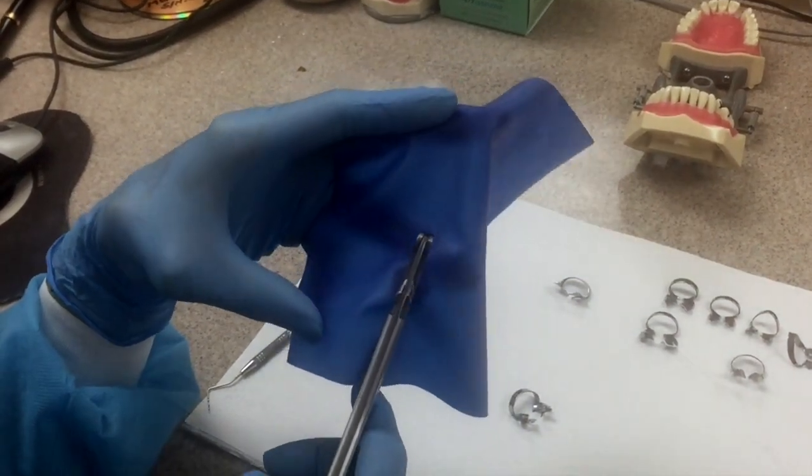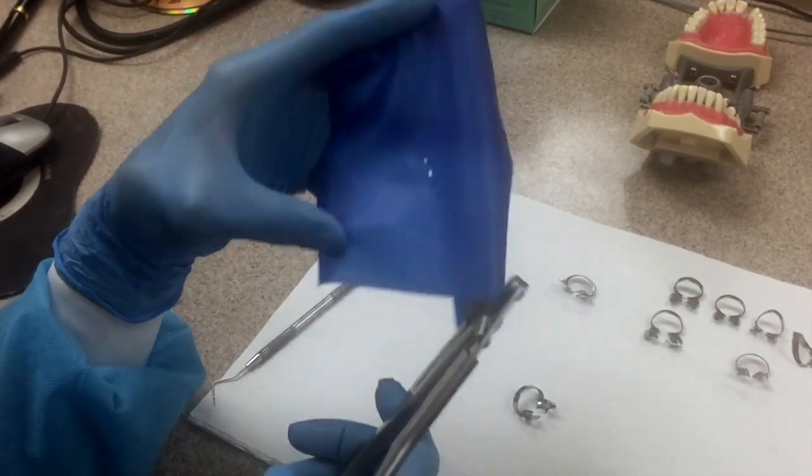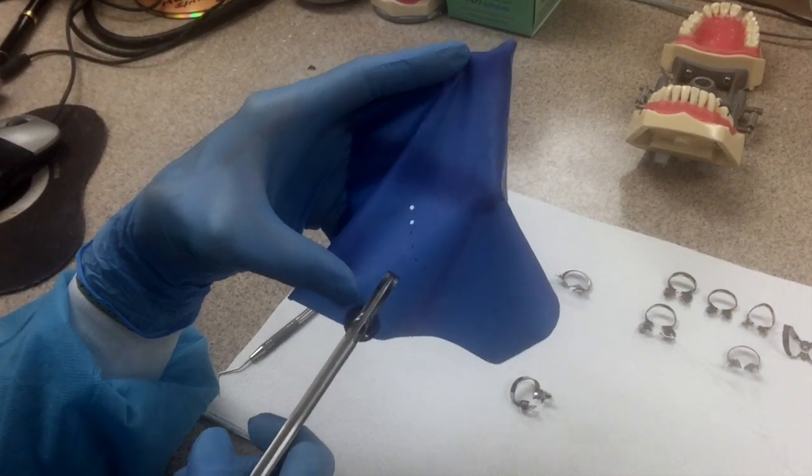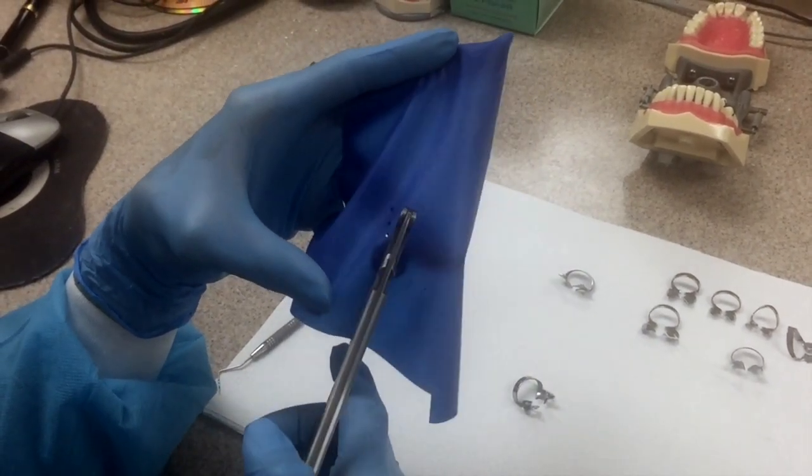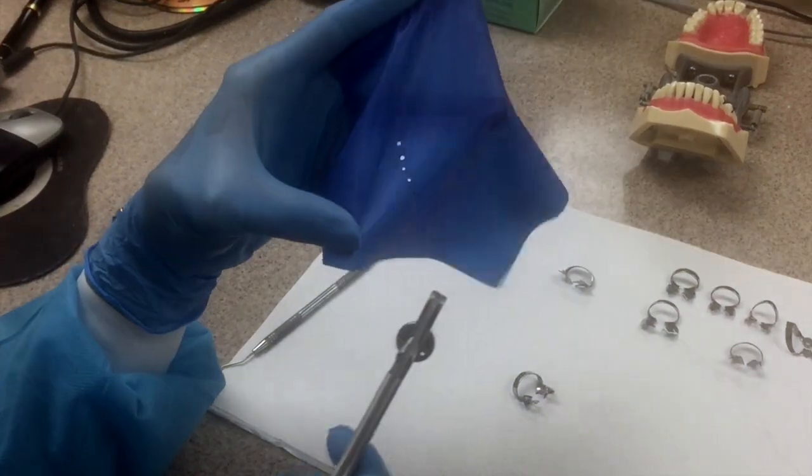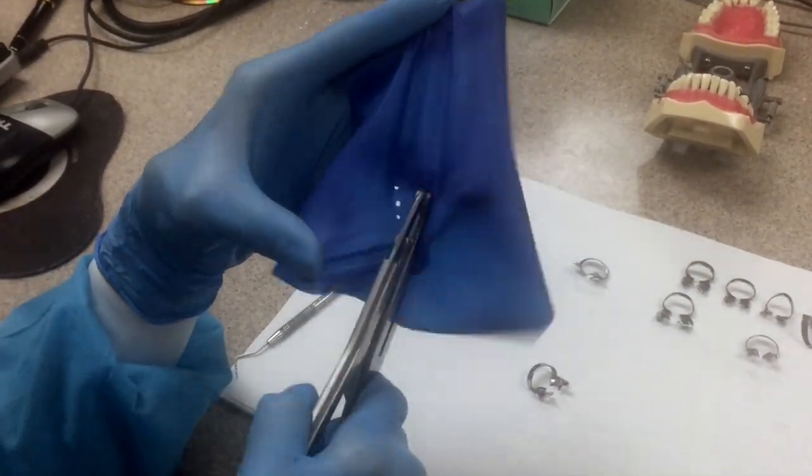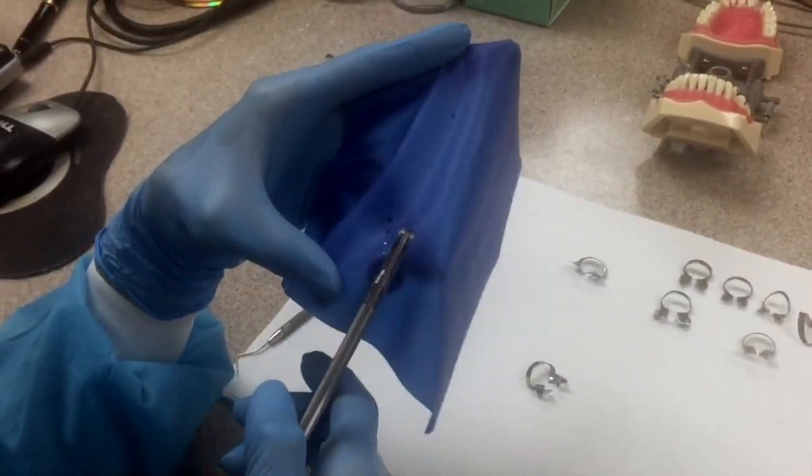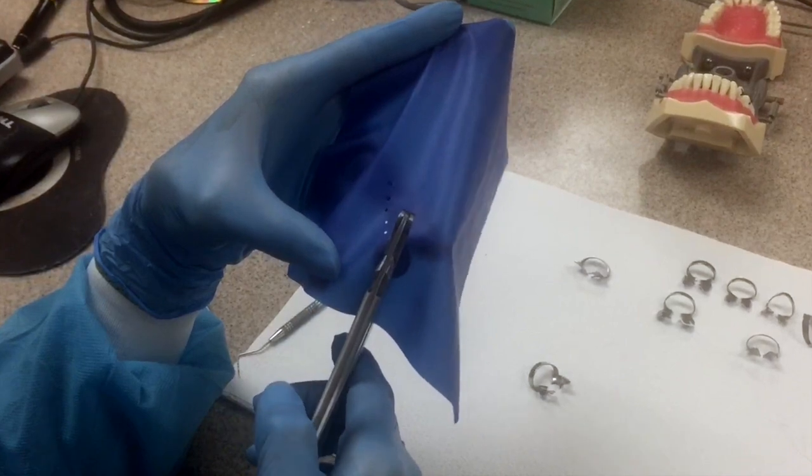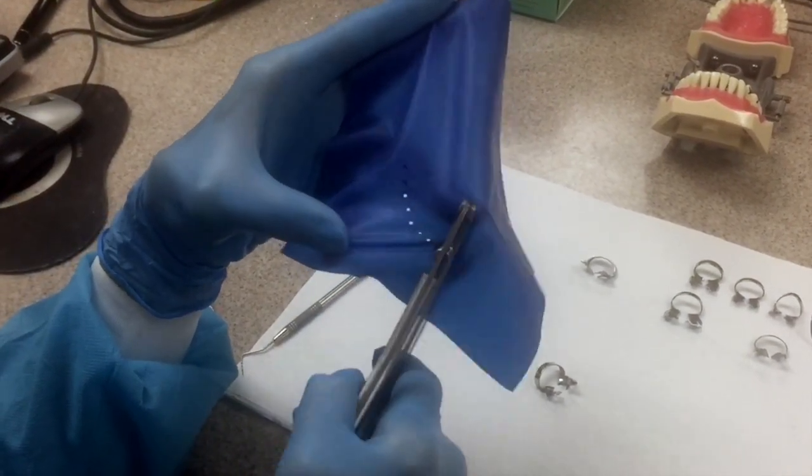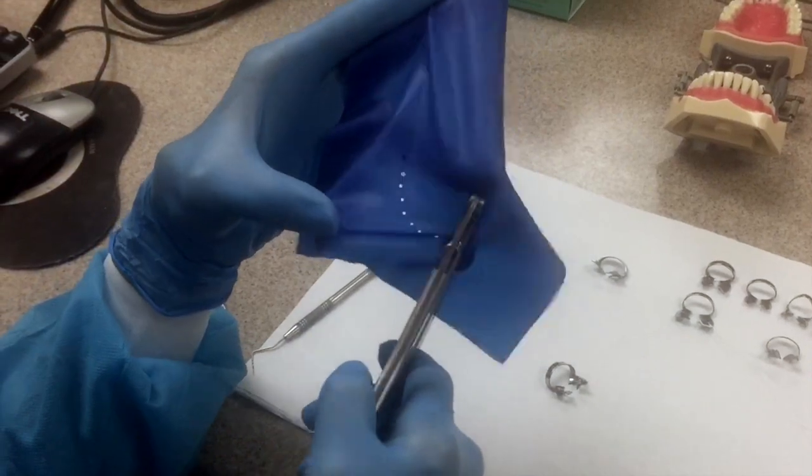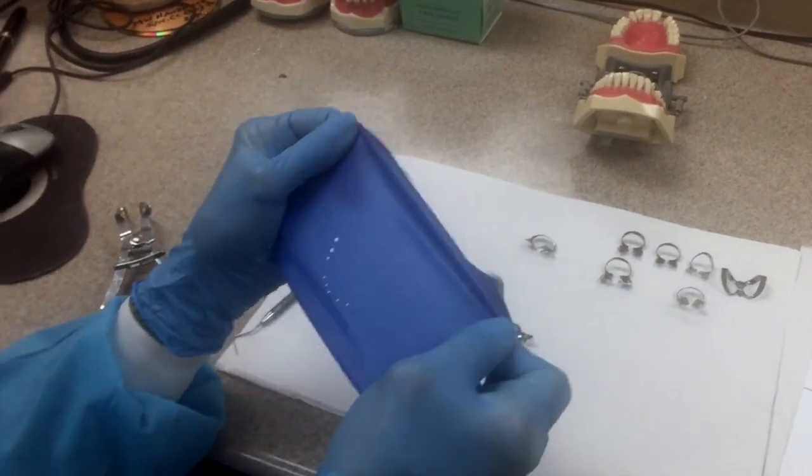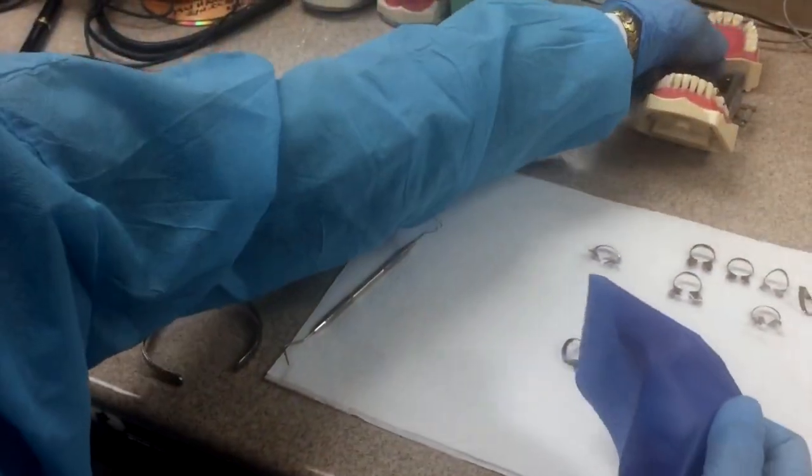That's tooth 31 and here's a hole for 30. Then we're going to make a smaller hole for our two bicuspids, then we have our cuspid, and even smaller for our laterals and centrals. I'm going to take this rubber dam all the way over to the opposite lateral.